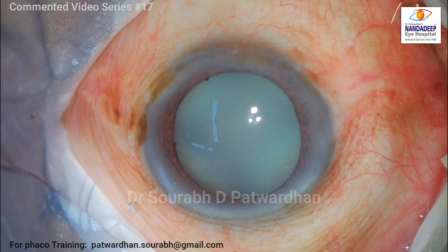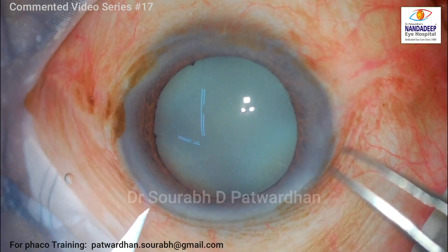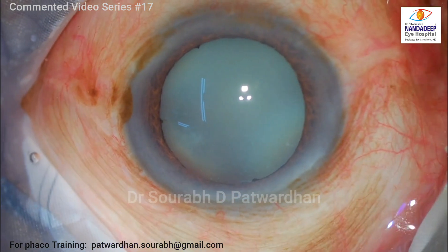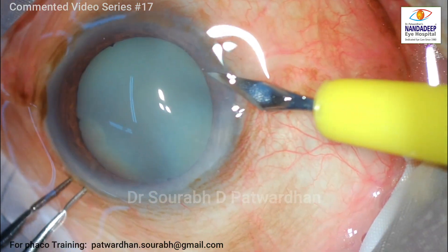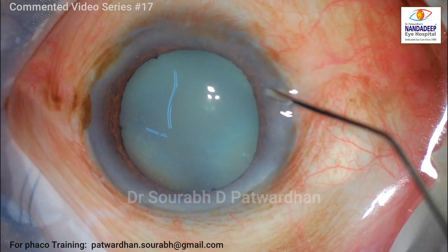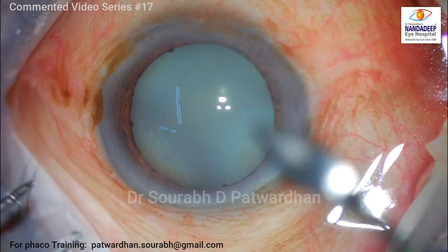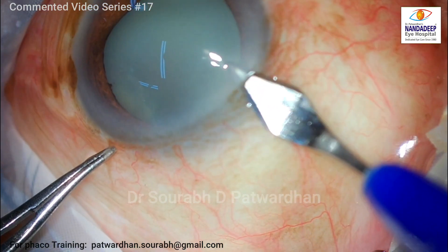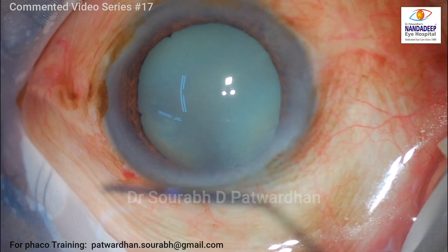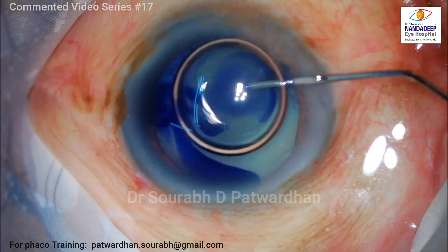Morgagnian cataract always poses a challenge because of various factors: the nucleus is highly mobile because the rest of the nucleus is liquefied, you have a redundant anterior capsule, and many times it is associated with zonular weakness. So for such cases you have to have a very controlled technique so that you don't damage the corneal endothelium and are careful about zonules and the posterior capsule as well.